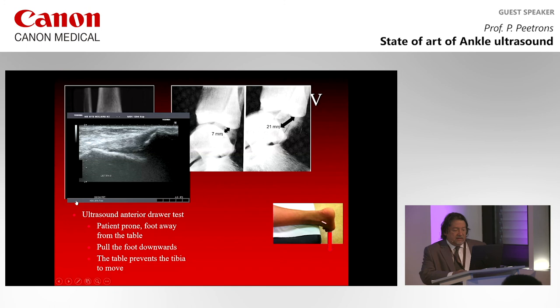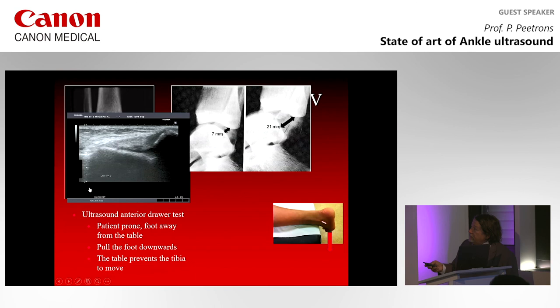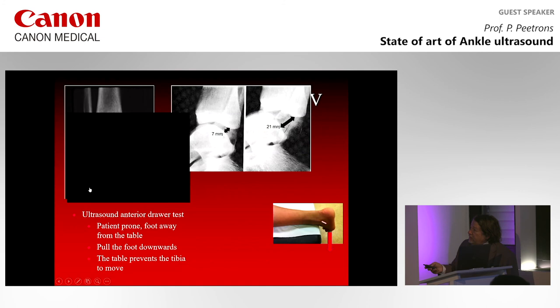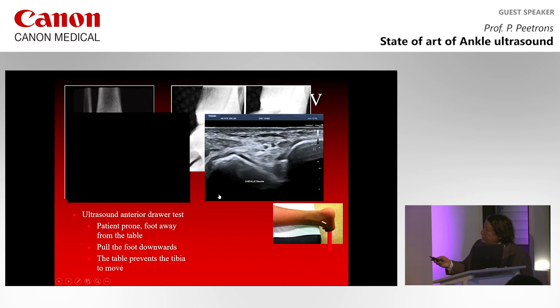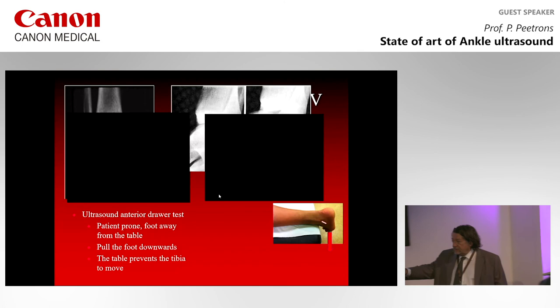Okay, you can see that when we pull the foot downwards, it is in tension, it is stretching, but there are no movements between the fibula and the talus. On the opposite, in this image, for example, you can see that there is a very big movement between the talus and the fibula because there is no ATFL between both bones. So I will show you how to do it now. So can you lie prone?